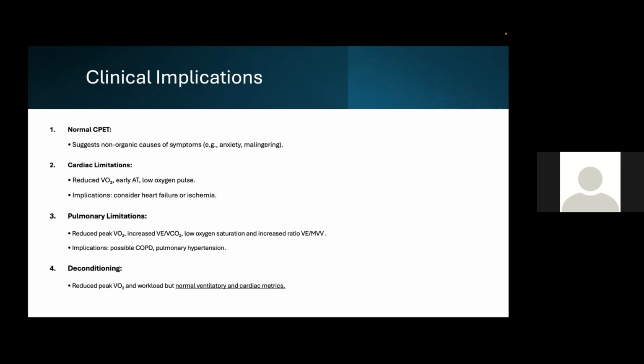The fourth is what we call deconditioning, where the patient will have reduced peak VO2 and workload, but normal ventilatory and cardiac parameters.